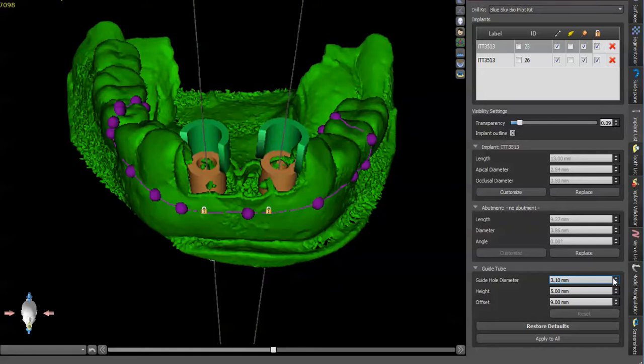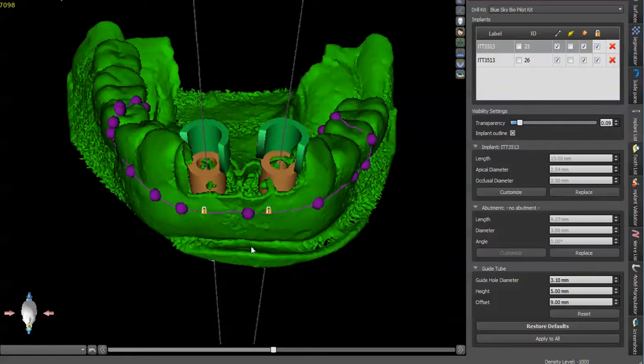Now if you're printing with a Row Box, you're going to want to increase this to 3.2. If you're using a Moon Ray or Form Two, you can keep it at 3.1. Why is this important?